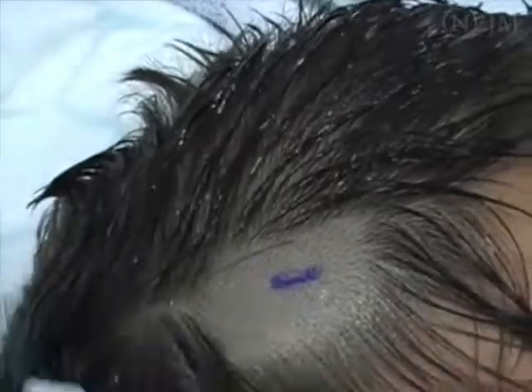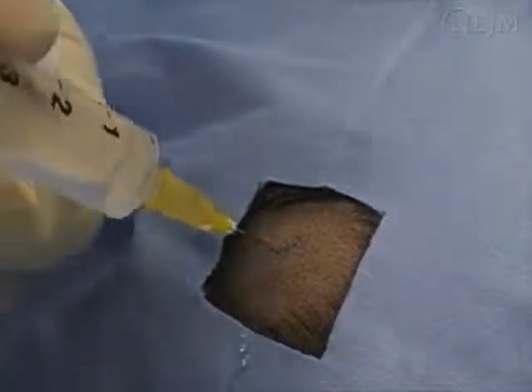Wipe the frontal area 3 times from the center to the periphery with an antiseptic solution. Then, place a sterile fenestrated drape over the head. Larger sterile drapes may also be used, but follow local guidelines. Raise a bleb with local anesthetic.